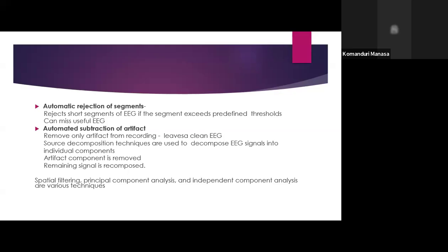Common mode rejection is another factor: a machine with adequate common mode rejection ratio, more than 120 decibels, ensures that common mode signals are adequately rejected. When we buy the machine, we have to ensure that there is an adequate common mode rejection ratio, so as to eliminate the common mode signals by differential amplification.